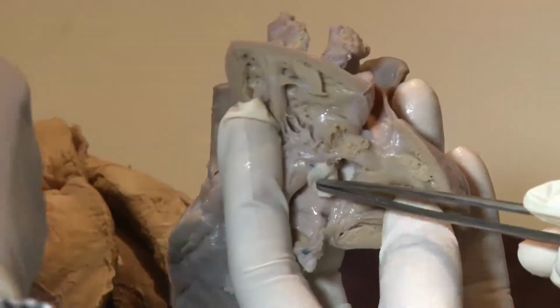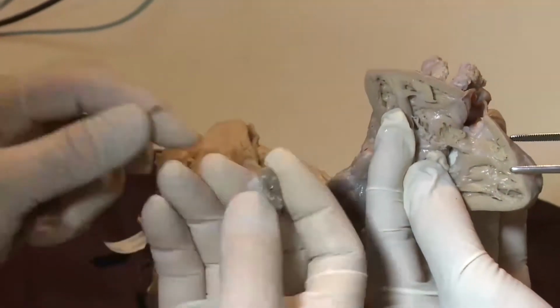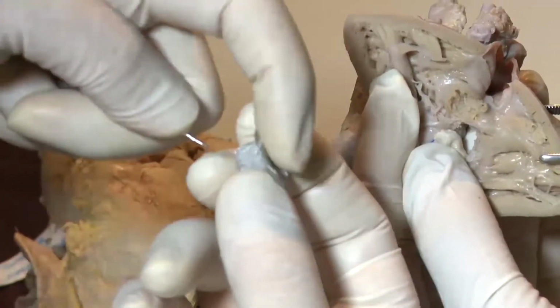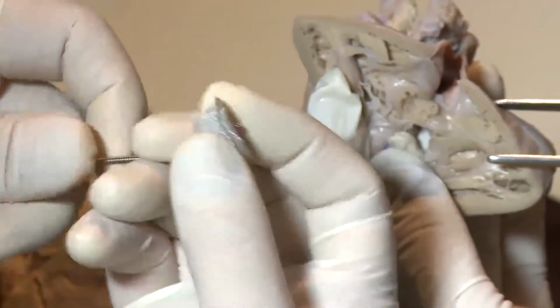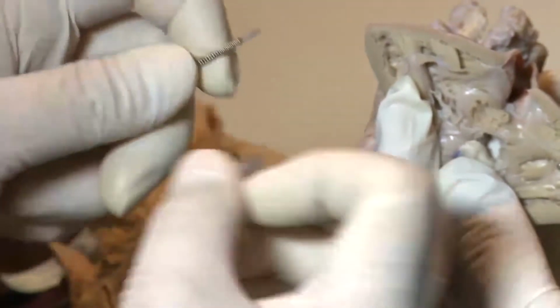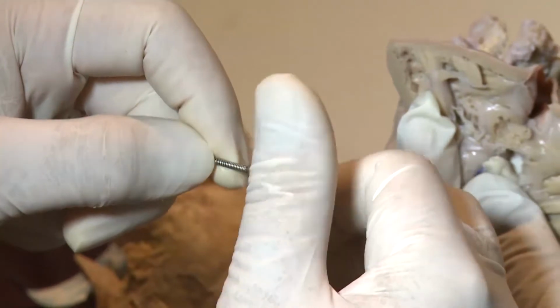So I prefer to use the Amplatzer ductal occluder, the PDA occluder. It has a left side disc, but no disc on the right side. So if I implant it in the VSD, it may not compress the AV bundle because there is no RV disc. So it's a little bit bigger one.